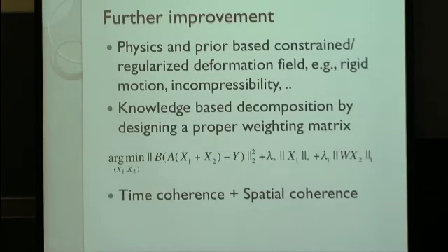Then you try to go back and improve the model. Again, for medical imaging, hopefully there is a lot of prior knowledge you can use. That's a very general model: you assume the deformation can be arbitrary, but many things are not arbitrary. For example, if you take an X-ray today and another tomorrow, maybe this misalignment is due to some rigid motion, you put the patient in different locations.